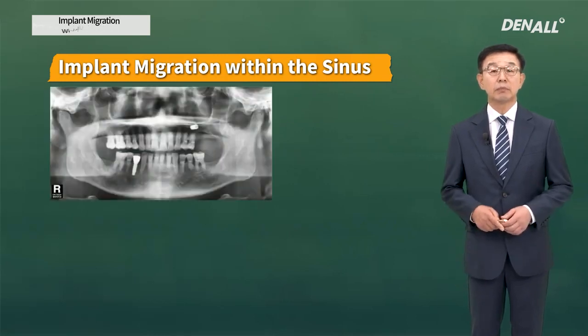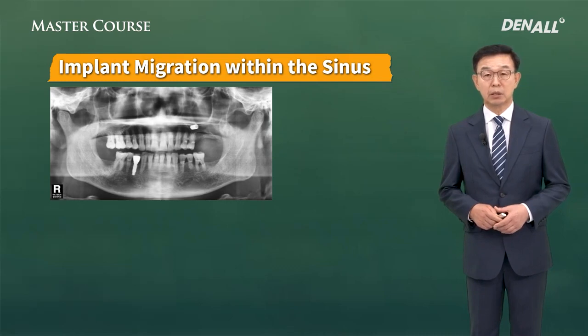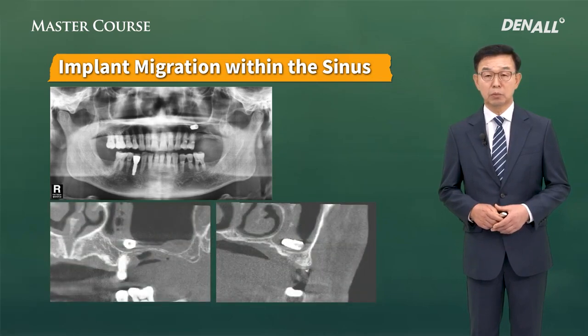In the case of this patient, the original intent was to place the implant in the upper left posterior area using a crestal approach. However, on the X-ray as shown, the implant has migrated into the sinus and the patient came to my dental clinic.